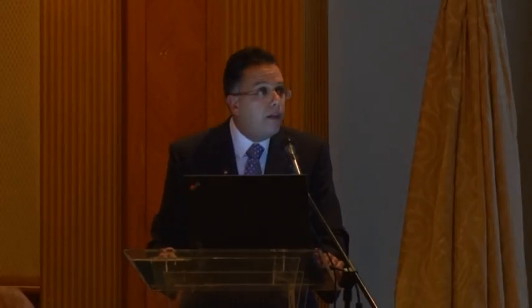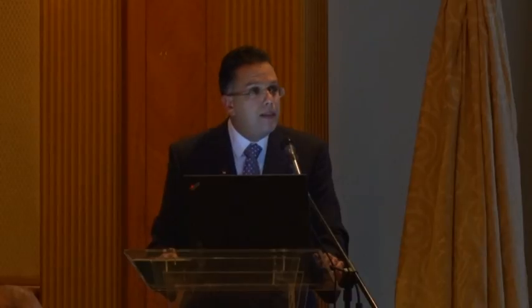Maybe we can detect some accidental findings, like for example, these pulmonary nodules. So it's very important to perform this calcium score, first of all, to calculate the amount of calcium present in the arteries, and the more the calcium increases, the more the risk of coronary artery disease increases, but also to detect any accidental findings. This is the first part, without contrast.